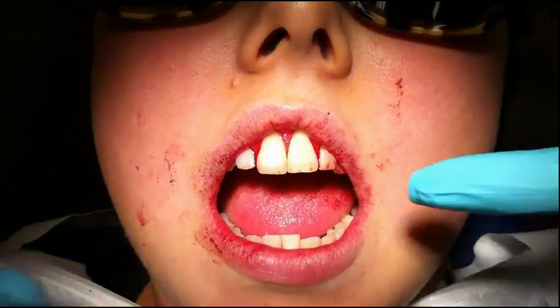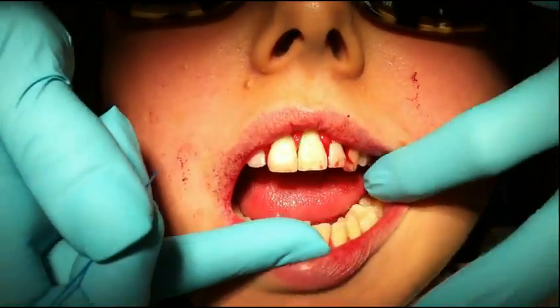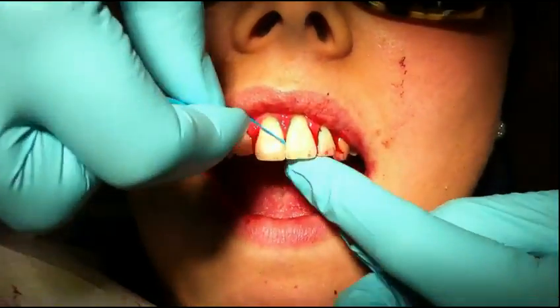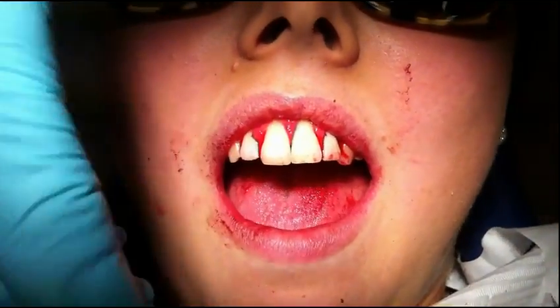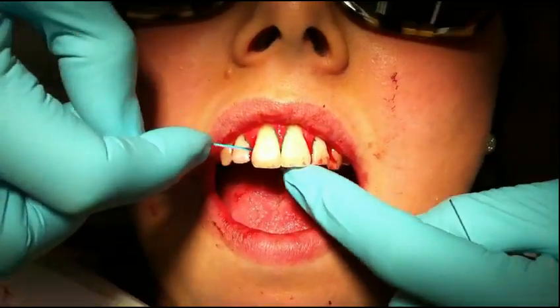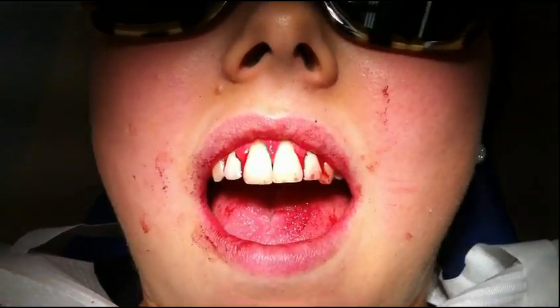We have a situation here with longer teeth and early periodontitis. The X-floss light is fabulous for cleaning a condition like this because the threader is easy to use to get through the interproximal areas, and then the floss is lovely and soft to go sub-gingival in a situation like this.